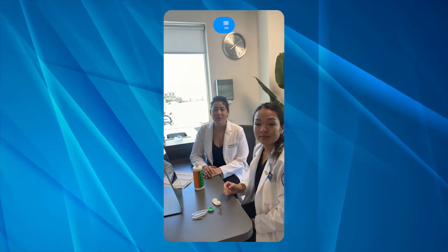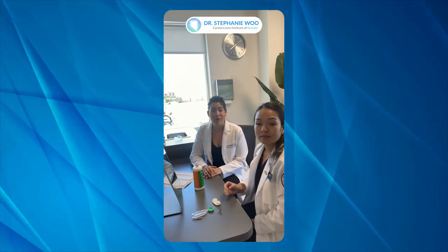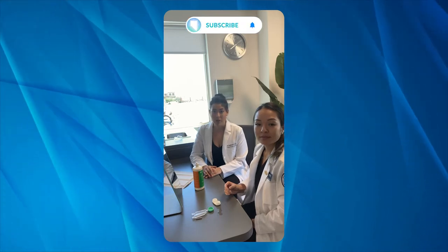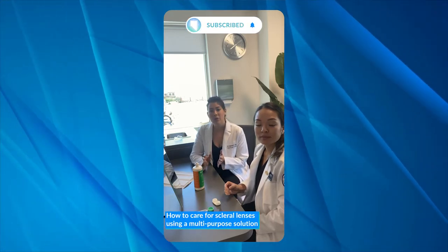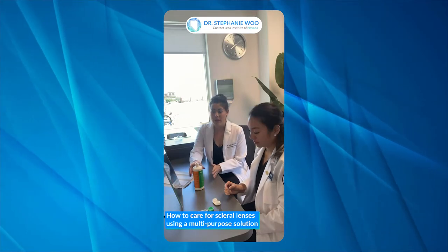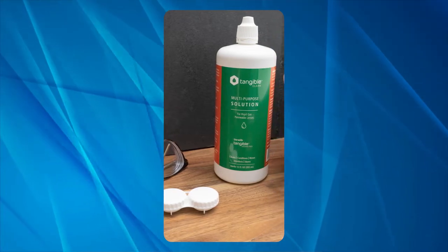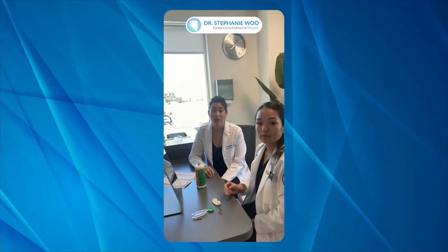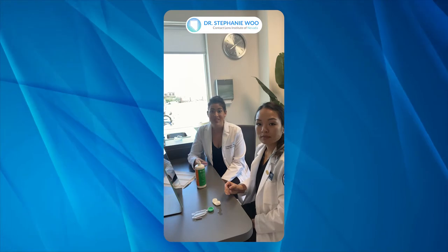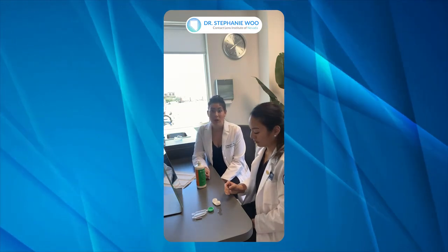Hi guys, it's Dr. Stephanie Woo with the Contact Lens Institute of Nevada. Today we're here with our intern Judy and she is going to demonstrate how to care for scleral lenses using a multipurpose solution. Today we're demonstrating with something called Tangible. This is a great product — a multipurpose solution that a lot of our gas permeable lens wearers and scleral lens wearers use.